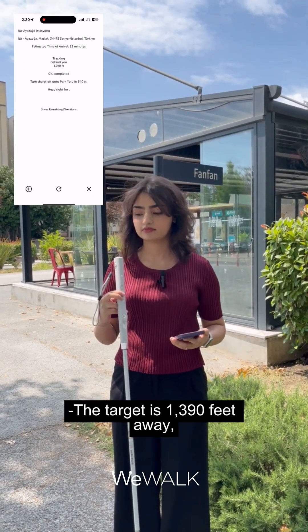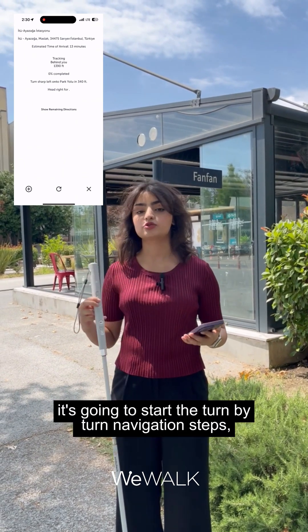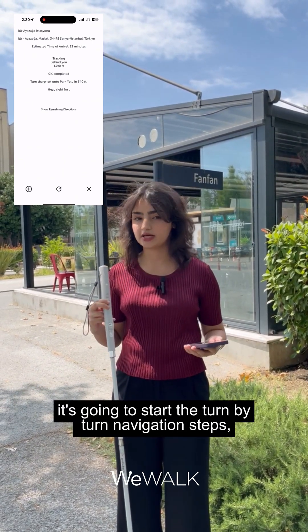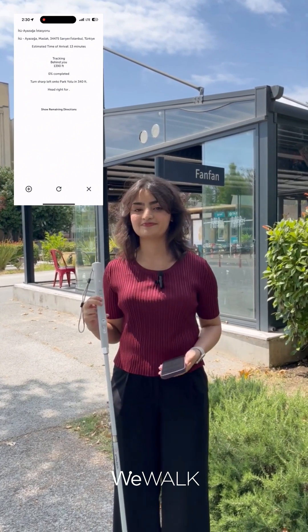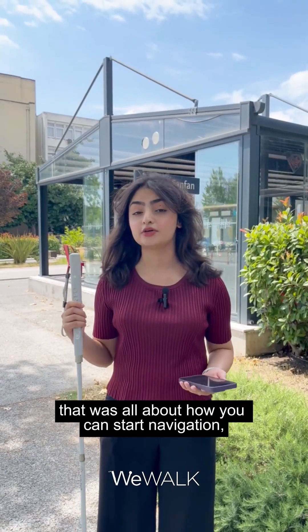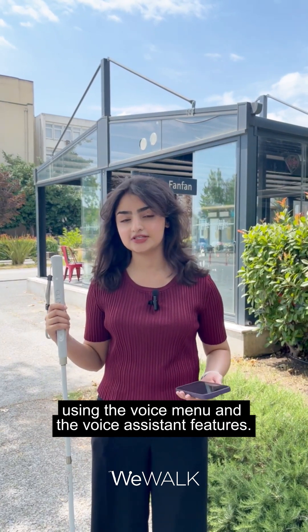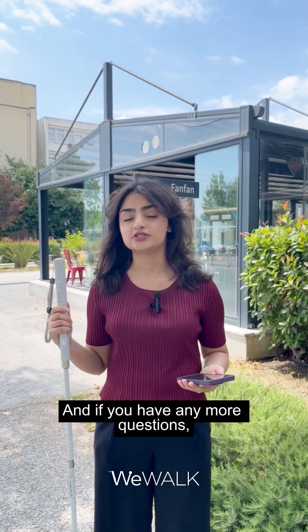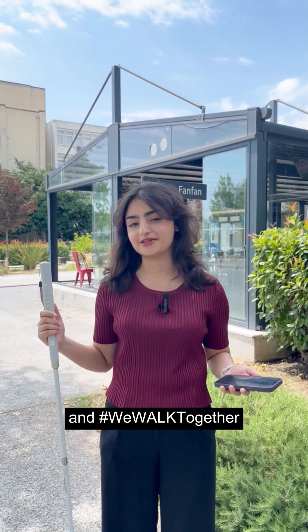The cane announces: 'Target is 1390 feet away in the behind you direction.' Now it's going to start the turn-by-turn navigation so I can follow the instructions and it will guide me to the Metro station. That covers how you can start navigation using both the voice menu and the voice assistant features. If you have any more questions, feel free to reach out to us at info@wewalk.io — and we walk together.